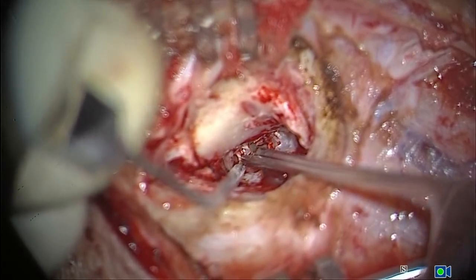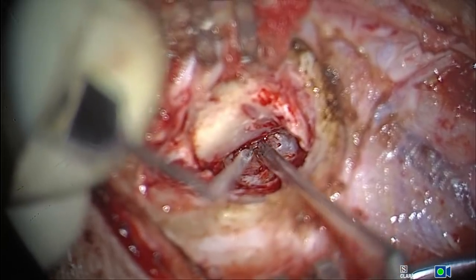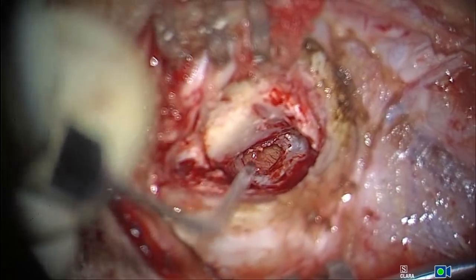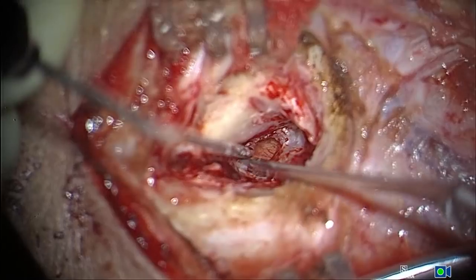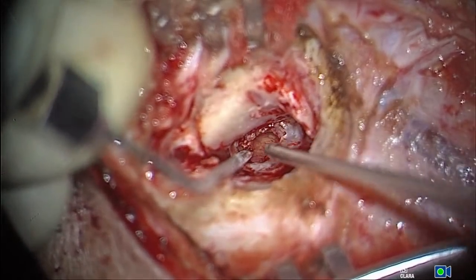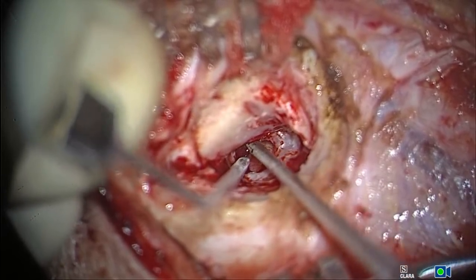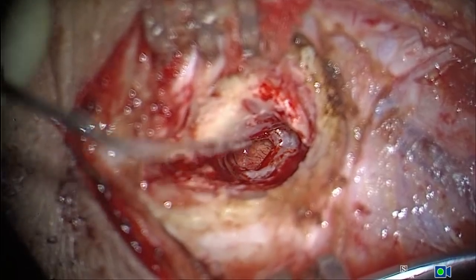Very gentle, and I'm trying to remove that. I can pull with a crocodile forceps. To me, that's not a great way. Okay, having done that now, give me the crocodile. Okay. So a little bit of that is remaining. Okay, that's perfect. Okay, that's beautiful.